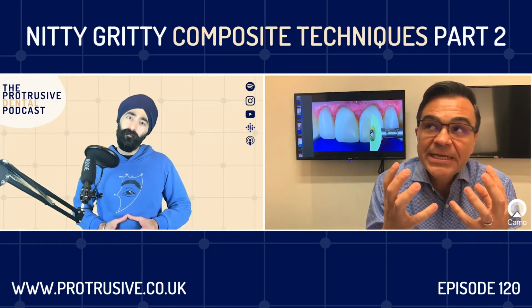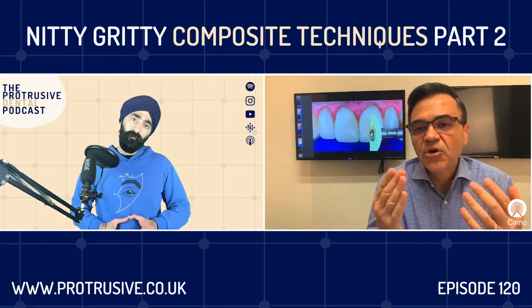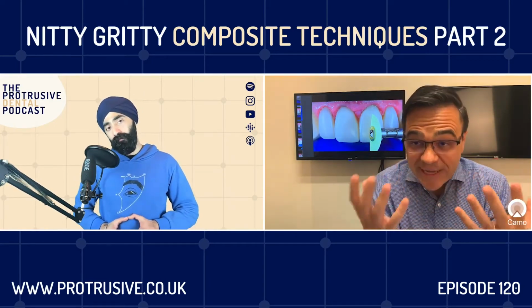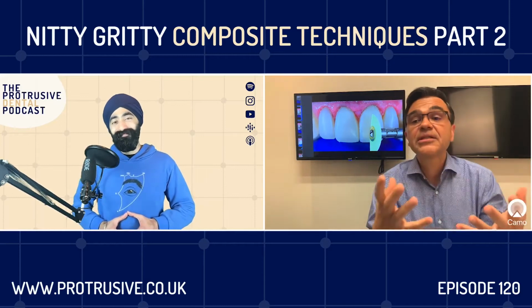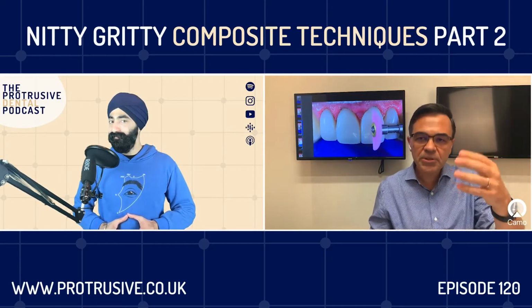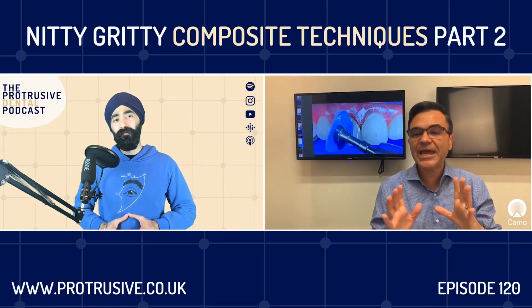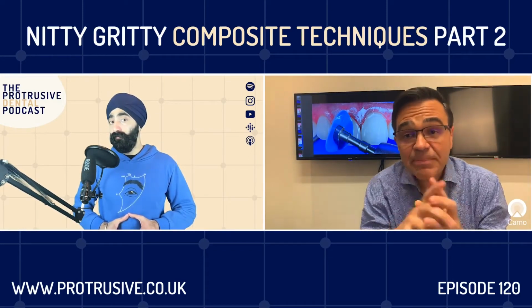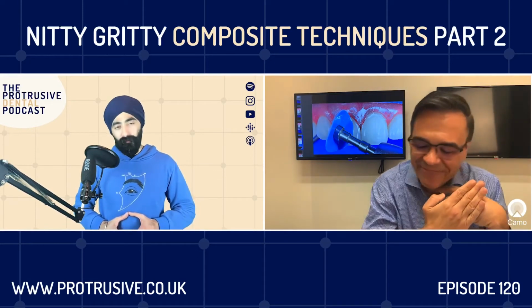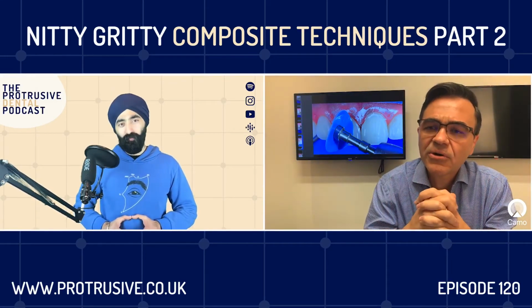And that polishing ability of the microfill composite will keep your veneers from staining. So if your patients come to your office every 6 months or once a year, when you look at them, they are not dull. They're still shiny, and it's because of this procedure of taking the blue disc, then the yellow disc, then the pink disc. Then what we use at the very end, we use an aluminum oxide paste with a buff, and you go through them first at very low revs, and then with water at very high revs, but with water, because you don't want to overheat your composite.